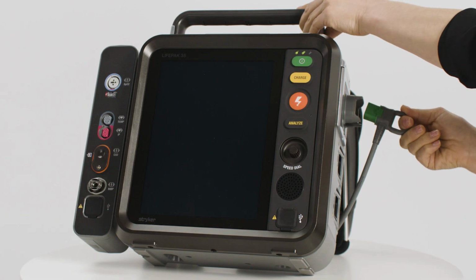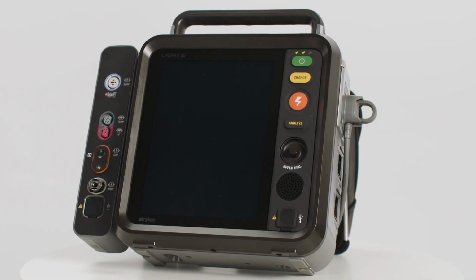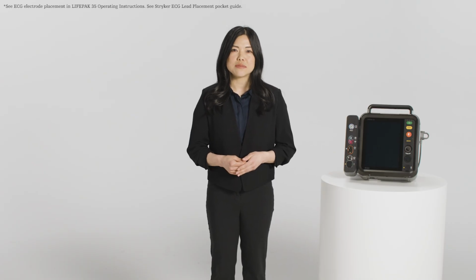Prior to obtaining a 12-15 lead ECG, good skin prep should be done to minimize potential ECG artifact. If not already connected, connect the ECG cable into the ECG port of the LIFEPAK 35. To obtain a 12 lead, first connect the V1 through V6 precordial wires to the 4-wire cable and the patient. Accurate ECG electrode placement is an important step in acquiring an accurate 12-15 lead.